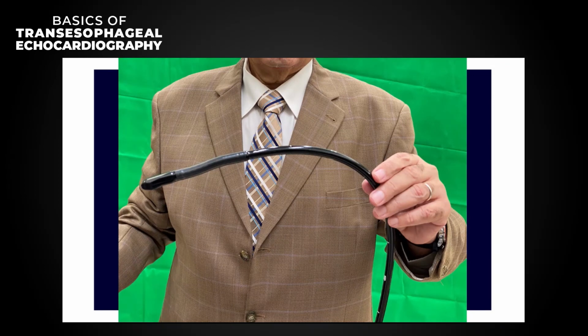But if he is in sinus rhythm, he might have a PFO, or there might be aortic arch atheroma, or a vegetation you didn't see. You are going to see it by TEE, or a small left atrial myxoma hidden somewhere. So the rhythm is not the indication; the indication to check for an embolic source is the presence of an unexplained embolic stroke, whether sinus or not.